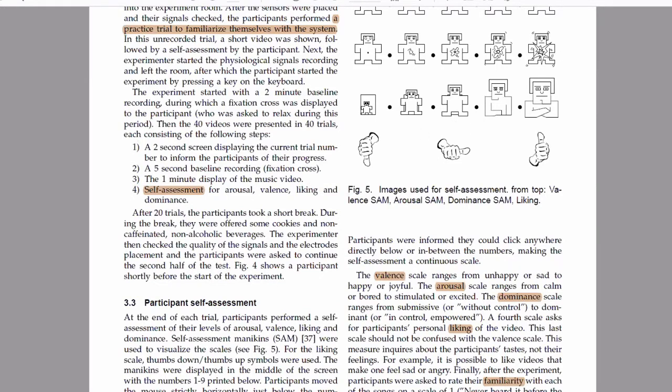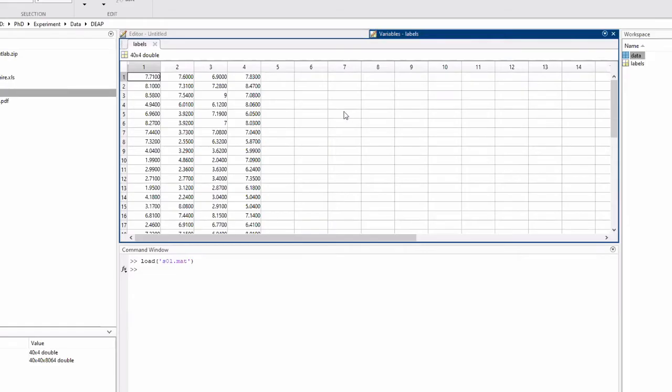So when we download the data, you will have this kind of data. It's all in a pre-processed MATLAB zip file, and when you open that, there will be 32 participants with all their EEG signals. As you can see, there are 2 variables stored in this .mat file.